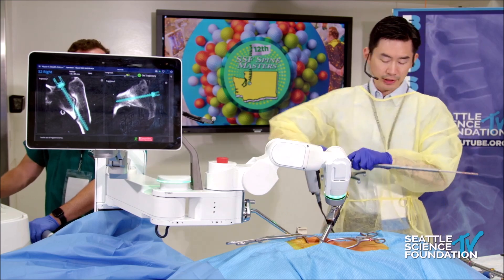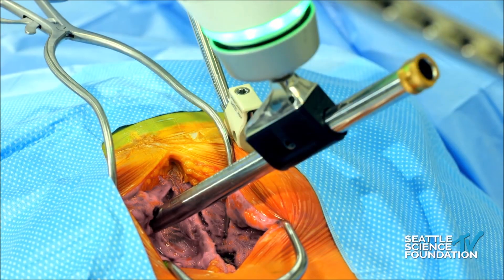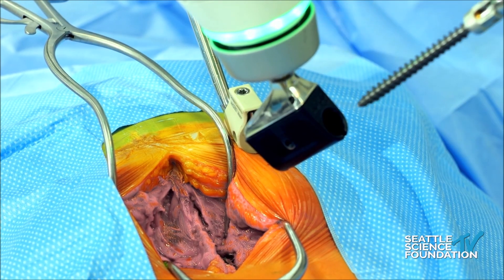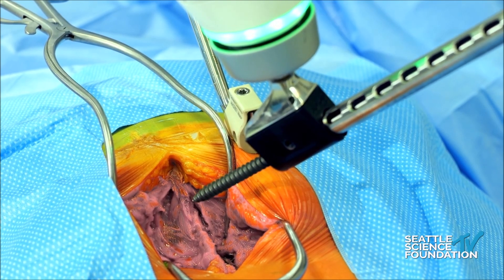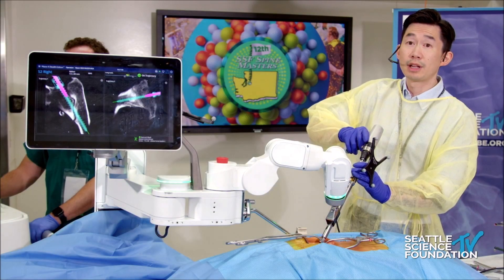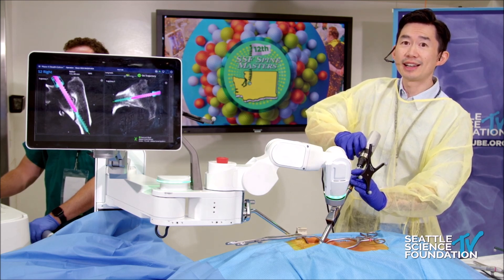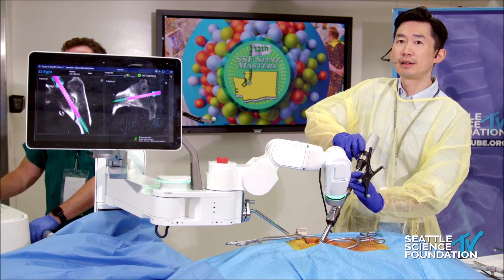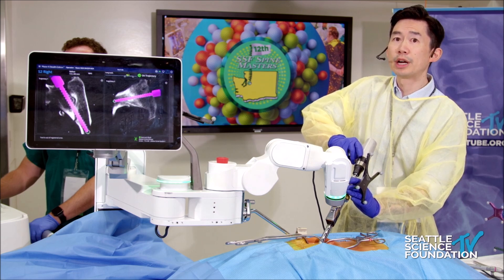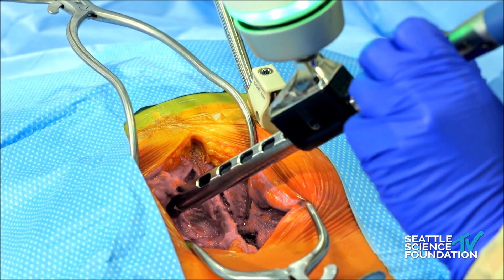And then the last is the screw itself. I do everything on power — it's certainly up to your comfort, but especially for surgeon longevity, power is really the way to go to make sure everything is in line with a very smooth delivery of force. You can see here the guidance of the robotic arm with placing of the screw. It seems almost mundane and straightforward, which really is a testament to how nice robotics is to place what was a very difficult screw at one point. Now you can place this screw, detach the drivers, and move on with the rest of the surgery.